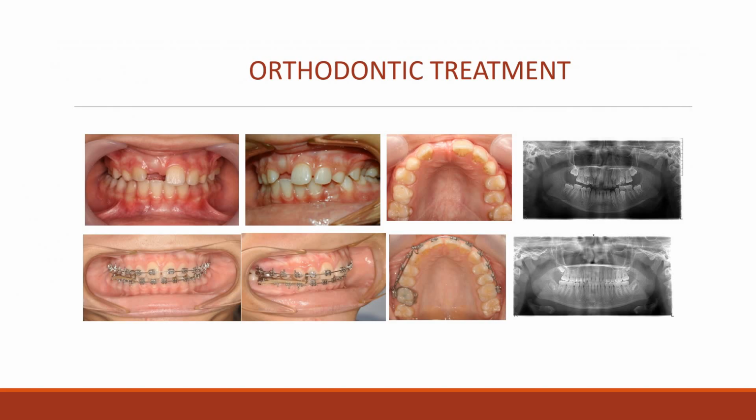Orthodontic dental appliances gently force teeth to move through the supporting bone to a desired position. The purpose of the appliances is to correct tooth crowding, overjet or protruding upper teeth, deep overbite, spacing problems, crossbites, and underbite or lower jaw protrusion.